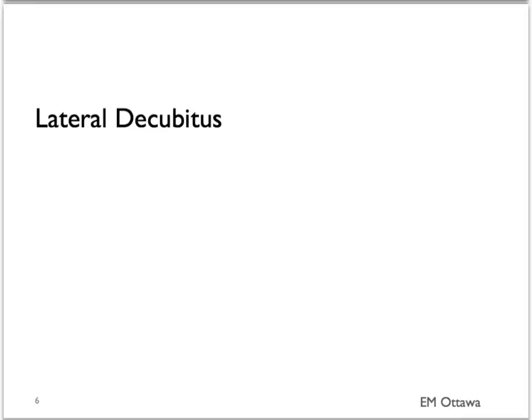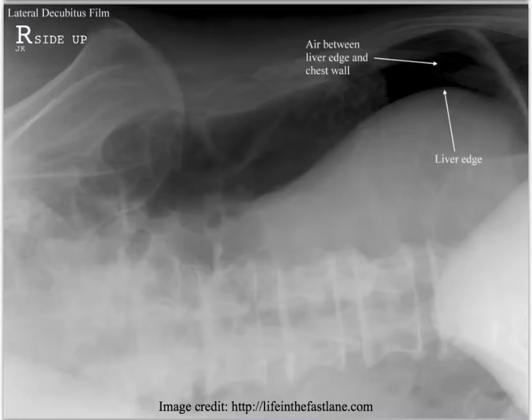What about if the patient is unable to sit up and they can only lie on their side, or in a lateral decubitus position? In this case, the free air does not rise up to the diaphragm. It will rise up towards the top part of the body, on the side. On an x-ray, the free air will be between the liver edge and the chest wall if the patient is lying on their left side.